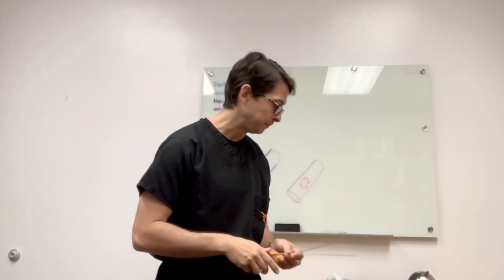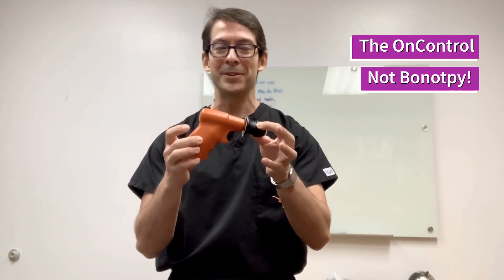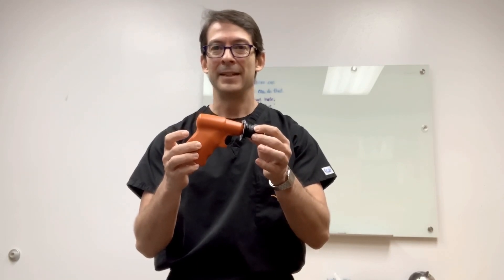If there's more lesion to sample, you can go again and do another centimeter. Once the coaxial is in, you can't change direction, so be sure you're in the right place. Then take all the needles out, hold pressure, and that's it. I do my bone biopsies with moderate sedation — not only because it hurts, but because the sound of the drill can be nerve-wracking for the patient. If the patient can receive sedation, I usually give it. That covers the OnControl system; we'll talk about the Bonopty in the next tutorial. Thank you for listening.